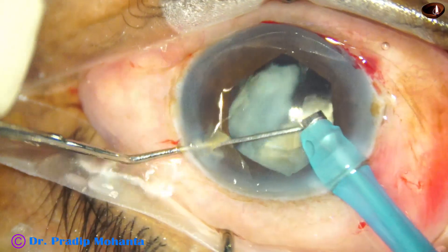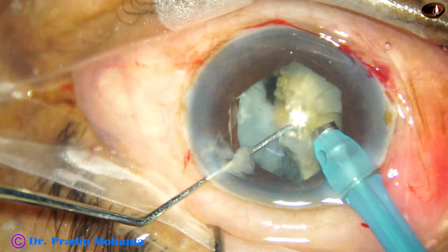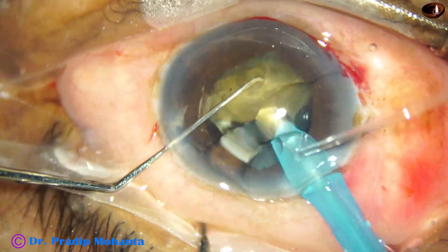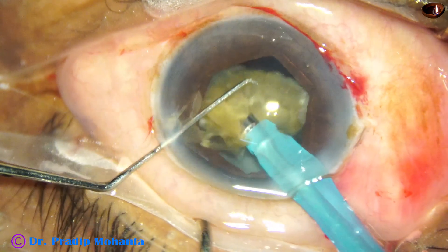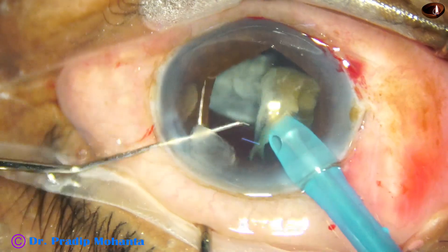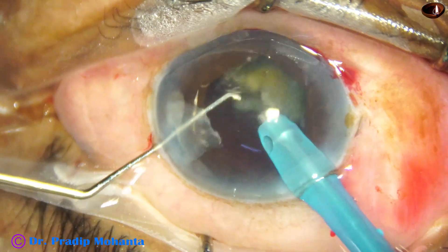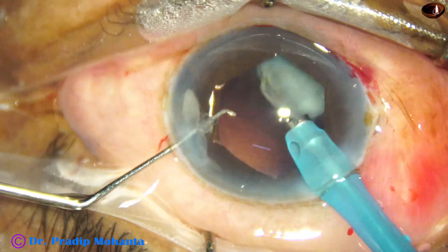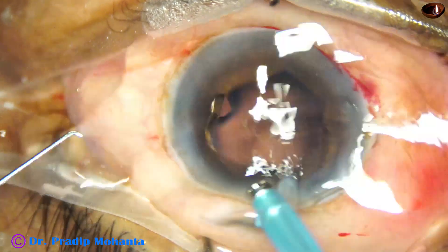Now we come to the other hemi-nucleus — rotate, go to the inner edge of the hemi-nucleus and start emulsifying. I am detaching the epinuclear shell to protect the posterior capsule, keeping an eye on the posterior capsule always. There is no to-and-fro movement of the posterior capsule, and cortical cleanup is almost done.